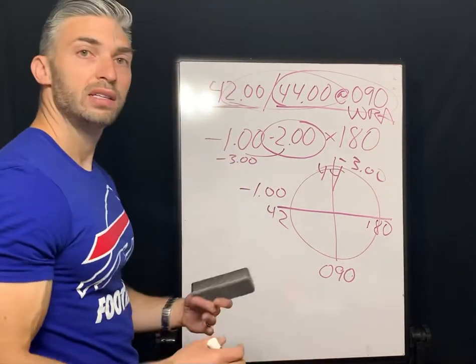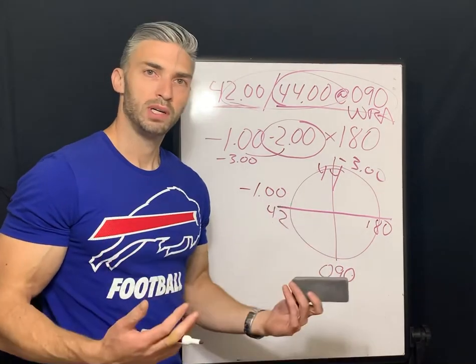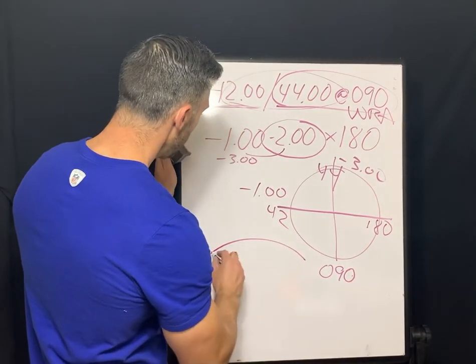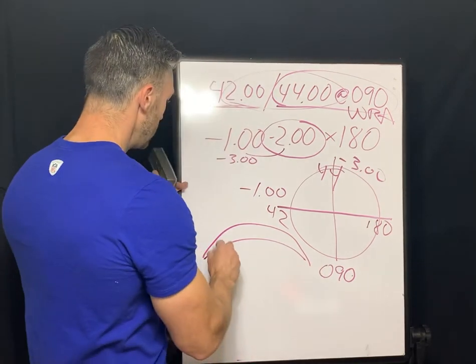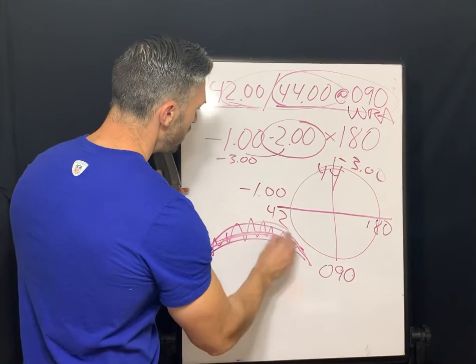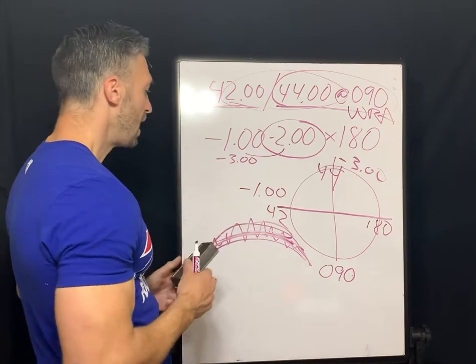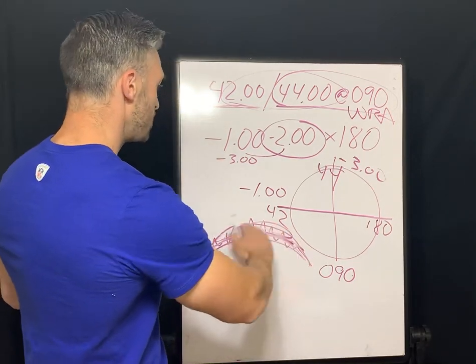And we can correct for a toric prescription with a spherical gas permeable. That's a lot to say, because when we apply that lens to the cornea, it's going to fill in with the tear film, and it's going to provide a new smooth refractive surface. That lens is actually going to overtake the cornea and create a spherical surface throughout.